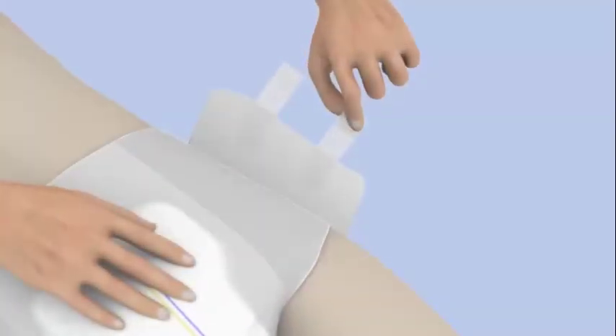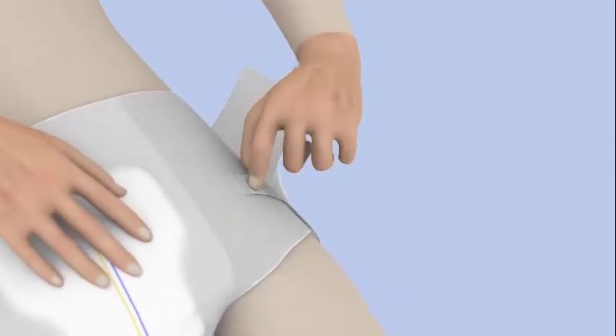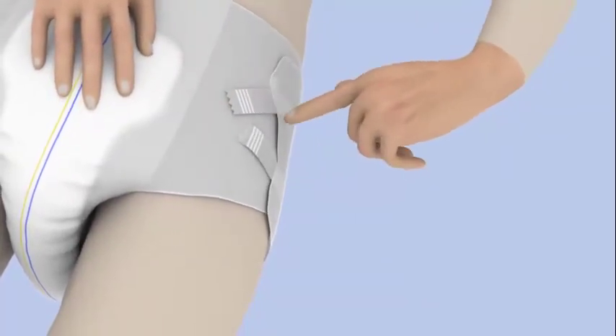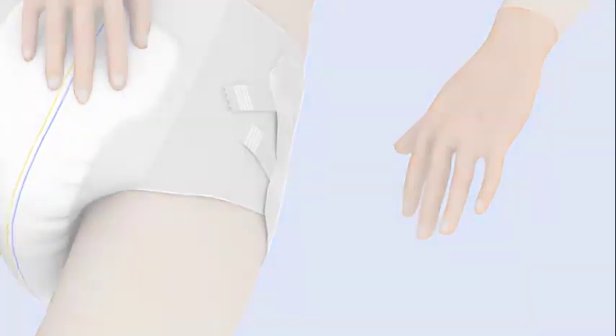Next, fix the bottom tapes in an upward position, assuring a secure fit around the legs. Then fix the resealable top tapes in a downward or horizontal position to ensure a secure fit around the waist. Finally, check for comfort and fit.